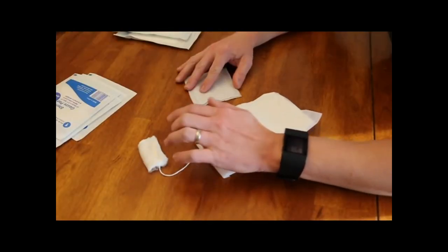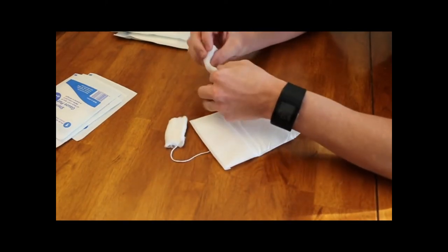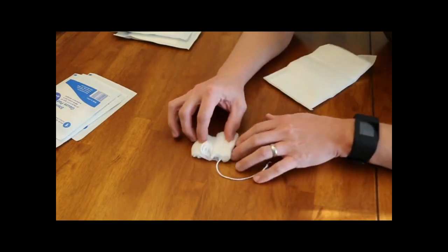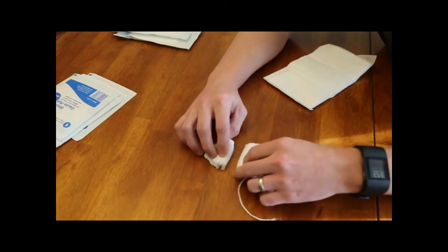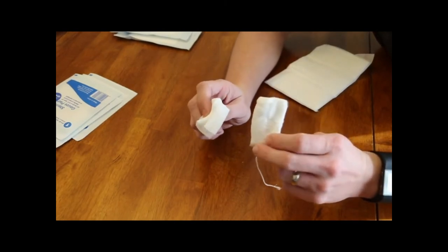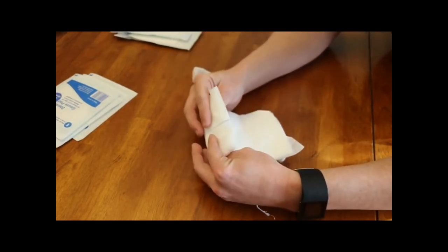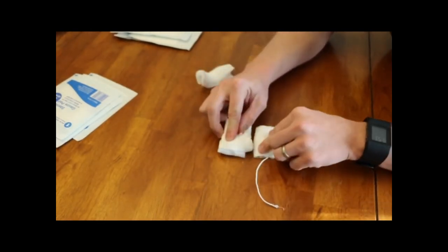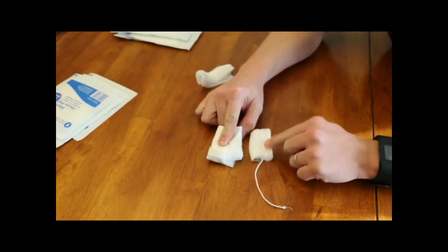Now let's compare this to the gauze that's actually in the tampon here. If we fold the 4x4 up, I get it kind of the same size-ish. You can see here that it's pretty close. Now obviously the tampon's more dense, but you're fairly close here. And this is the one we said we would use for minor bleeding. So really, how much more absorbent is this? If we talk about the 5x9 here, this is the one we said we would use for the moderate to heavy bleeding. There we go. You can see the 5x9 is going to absorb a lot more blood than the tampon.